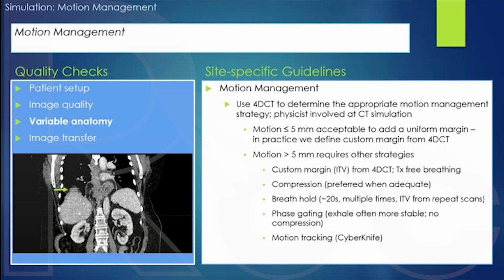And so this first question is, what motion management strategy typically results in the shortest treatment time? And this is in the context of, say, lung SBRT or liver SBRT, one of these disease sites in the chest or the abdomen.